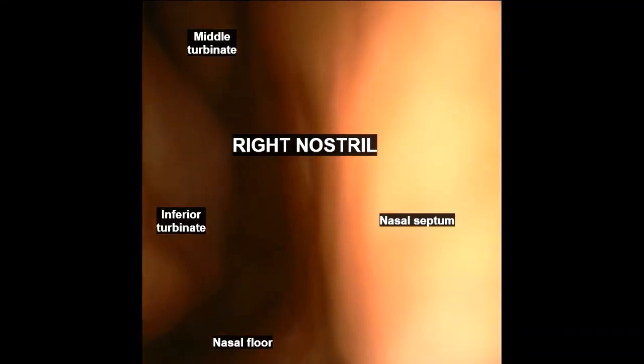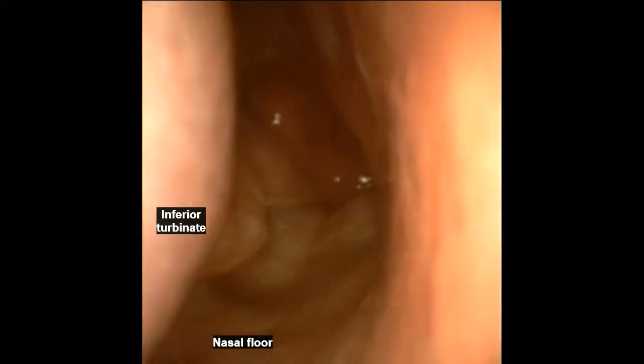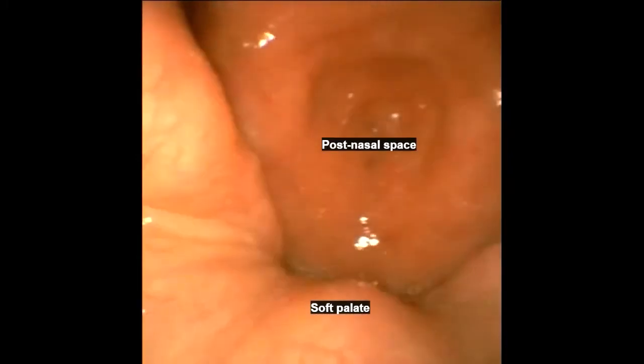Today I'm going to show you how to take a fish bone out through the nose. This unfortunate patient swallowed a catfish bone which got stuck in their throat. They turned up to accident and emergency and were referred to the ENT department.